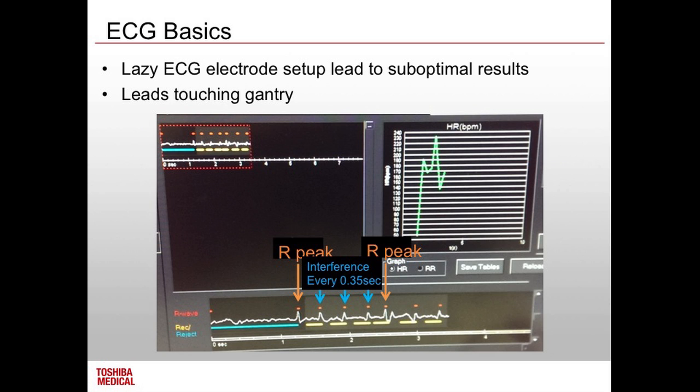Again, that's just a bad setup. And again, you guys don't really have to worry about it because this is off a prime, which is the 80 row detector. You guys will be doing it in 1 beat, and we'll talk about that. That's just showing what an R peak is. And they're not R peaks apparently.